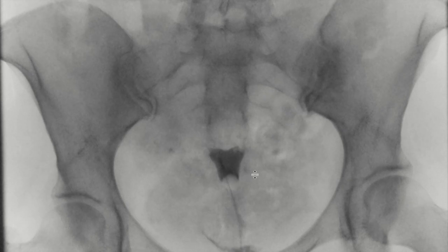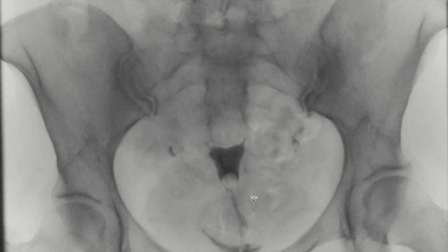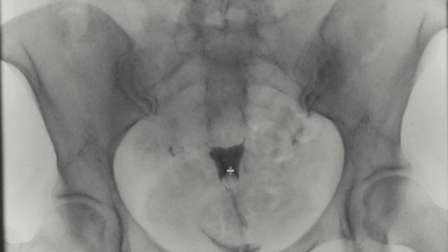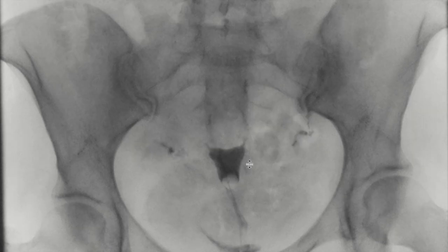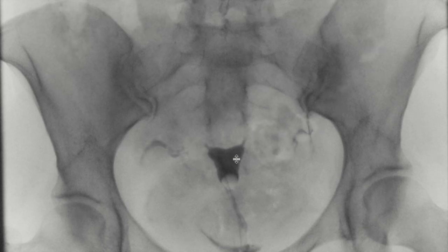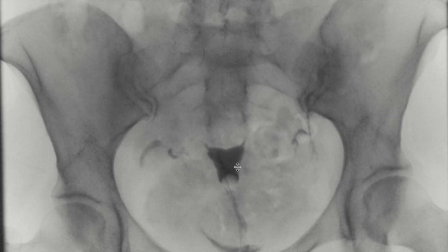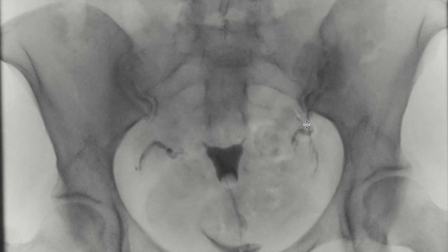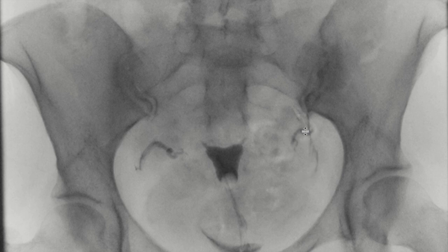You can see that the endometrium is now getting distended, and then eventually you can see that there is actually flow going within the fallopian tubes on both sides. What you're looking for is tubal patency, and that is demonstrated when you start seeing contrast going outside of the fallopian tubes and into the peritoneum.